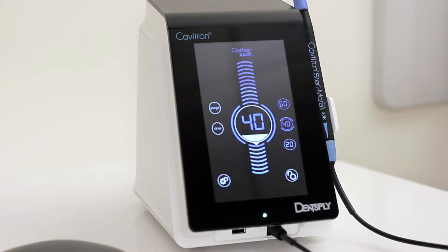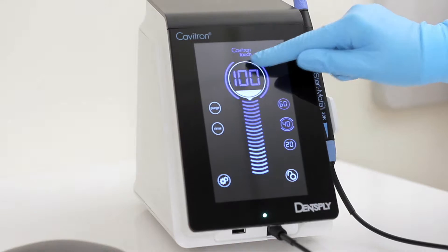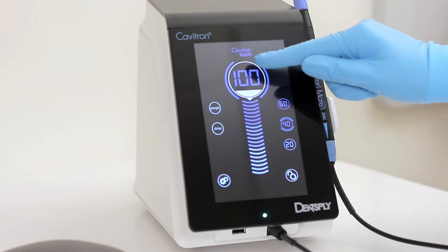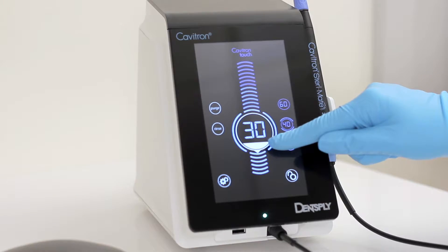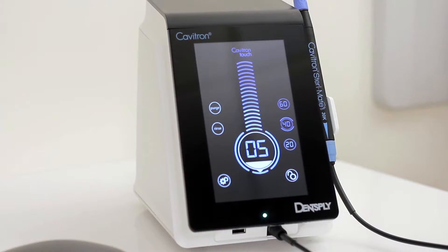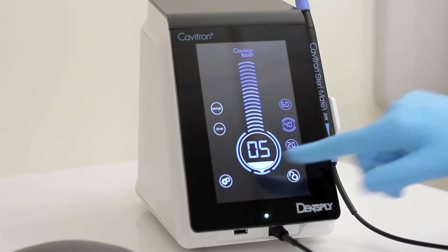The center of the screen contains the power level control. The number displayed in the bubble indicates the percentage of maximum power, ranging from 5 to 100, increasing or decreasing in increments of 5 when it is held and slid up or down. The power level can also be selected by touching the scale either above or below the bubble.